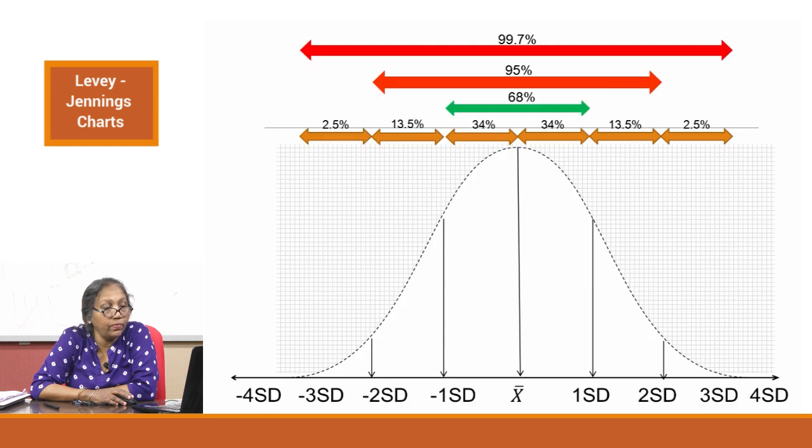So now let's go back to our Gaussian. I hope you remember the basic principles that we talked about, the probabilities and percentages that fall under each standard deviation. To recap, we learned earlier on that 68% of the data points will fall within the 1 SD region, 95% will fall within the 2 SD region, and 99.7% will fall in the 3 SD region. So that is how far, under normal circumstances, the data points will fall.